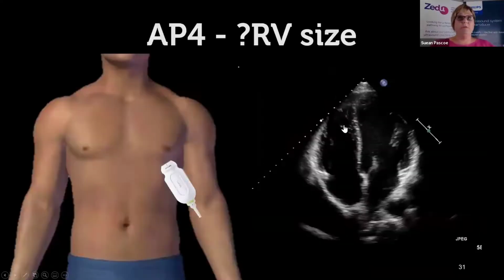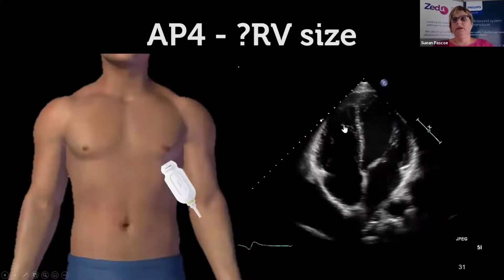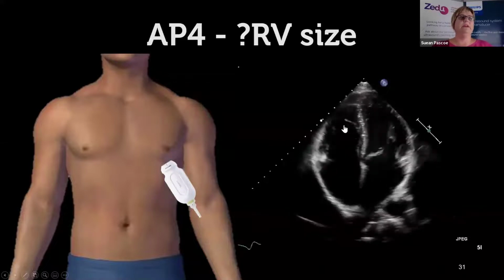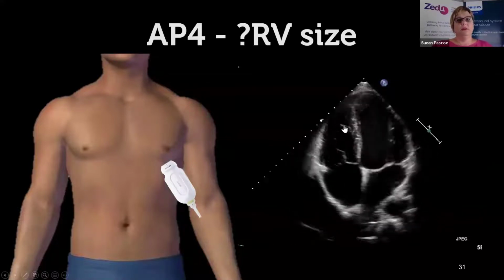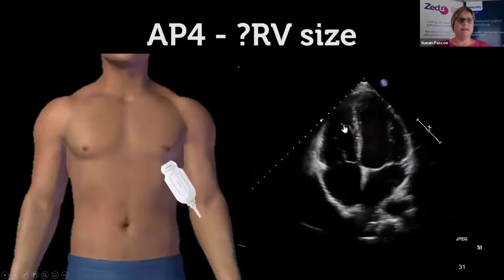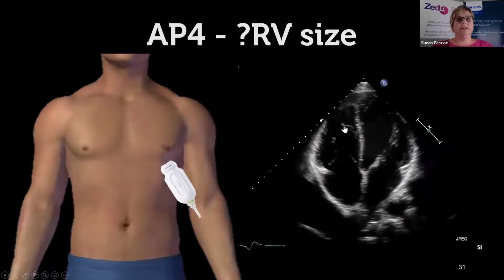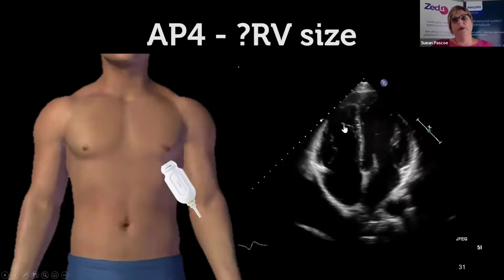Now, the apical four-chamber view is the next view that we look at. This one's a real doozy to get. I think it's quite difficult. Part of the difficulty here is that your sick patient is often supine, and this view is best demonstrated with the patient lying on their left side. What that does is let the heart fall a little bit out laterally so that we get better windows to the heart. But when your patient's supine, you've just got to get whatever you can.